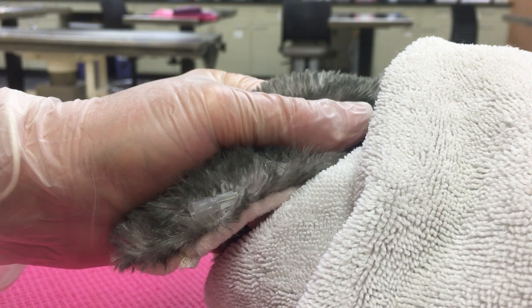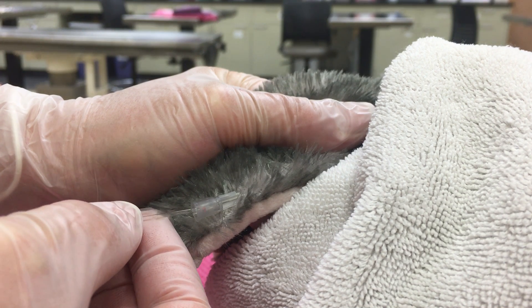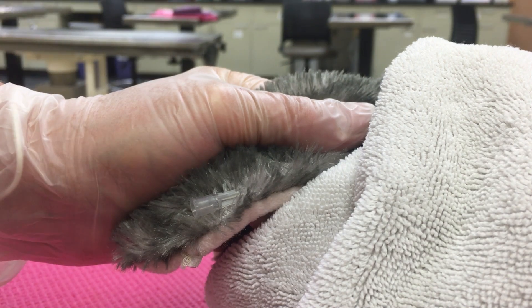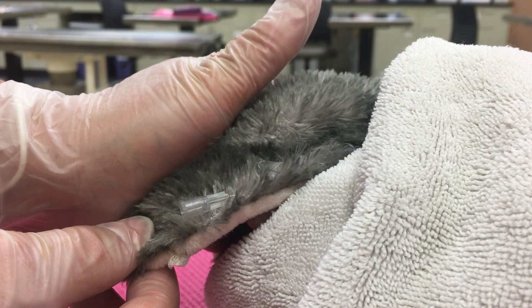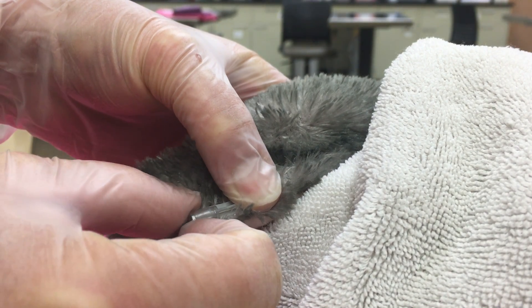So I'm holding the ear. Then I take my hematocrit tube and just harvest the blood out of the hub of the needle. Get my blood. I'm going to release pressure at the proximal part of the ear and hold off at the venipuncture site.